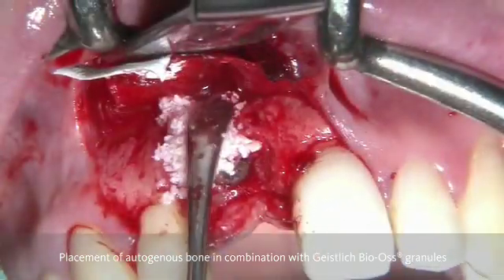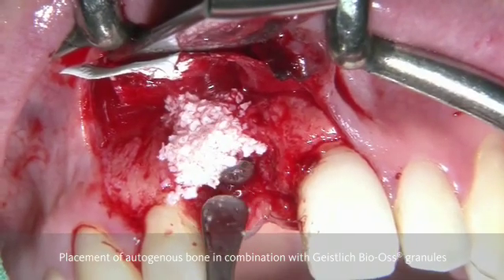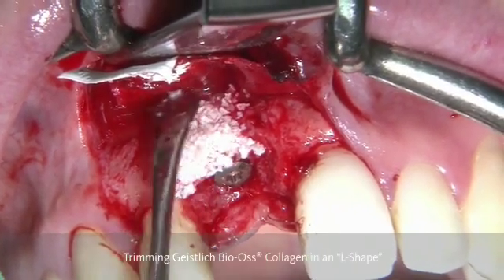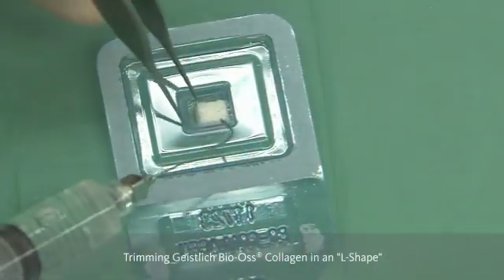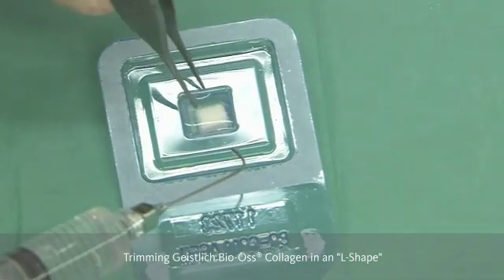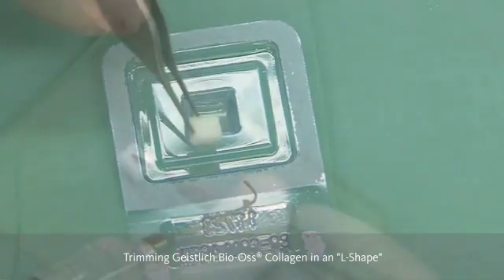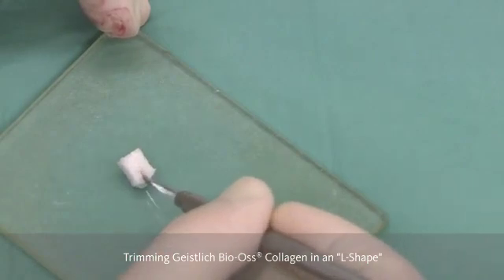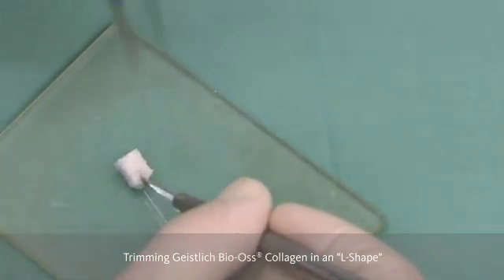In order to cover the exposed implant, we are going to place autogenous bone either with or without the Bio-Oss granules, and this is the bone regeneration part. Now, in order to further go one step in the aesthetic area and do a bone contouring, we are using the Bio-Oss collagen and shaping it according to an L.